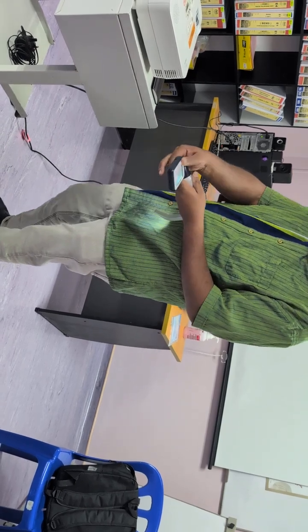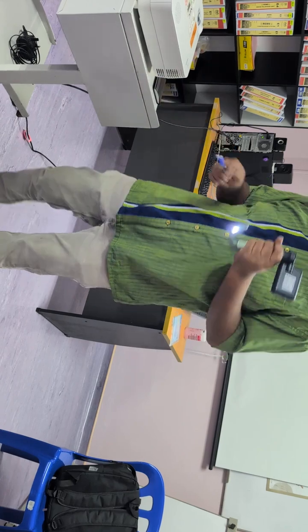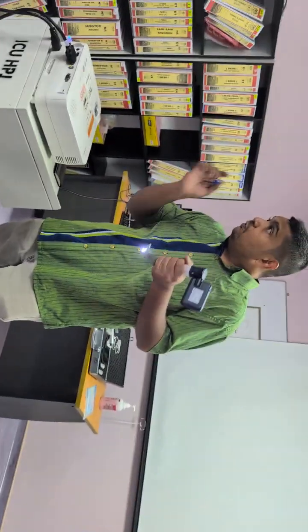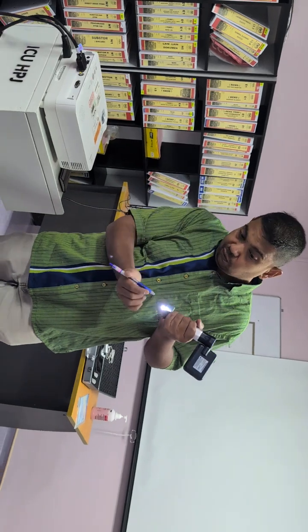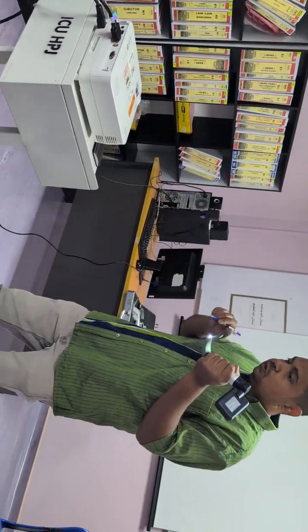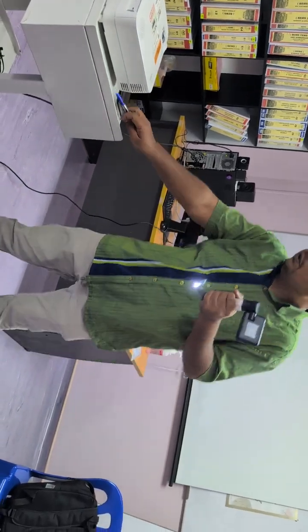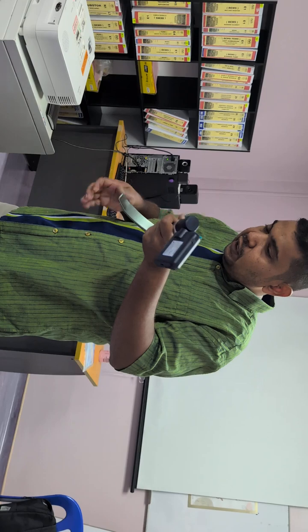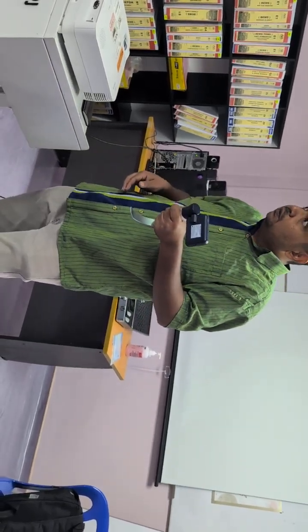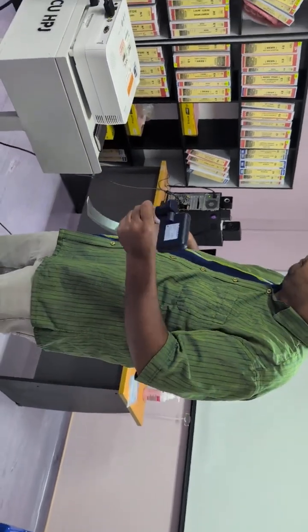The moment you are done, you do not go in full. You have to understand this, okay? The camera is here. If you see the vocal cord right here, there's no way you're going to intubate. Because the tube is going to go down. The tube is not going to go up. So when you use a video laryngoscope, midline, halfway through, lift. If you cannot see, go down, go a little bit more in, lift.